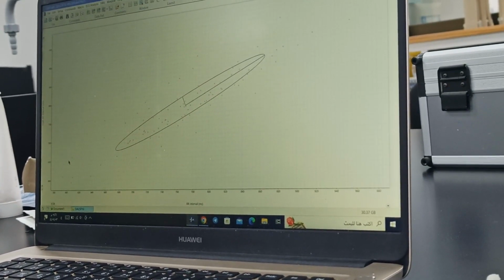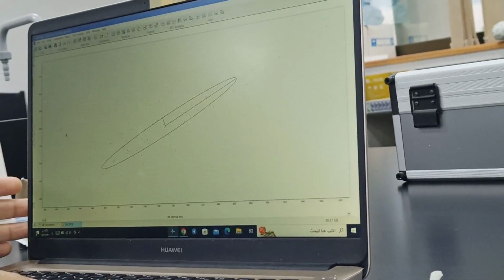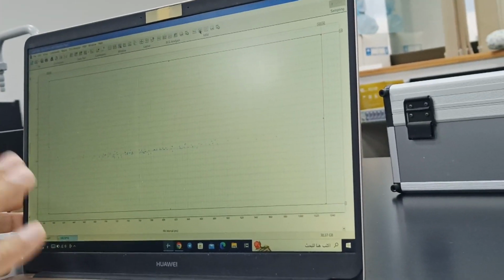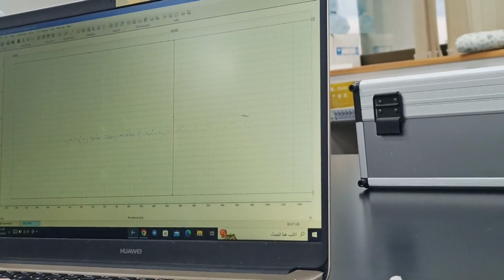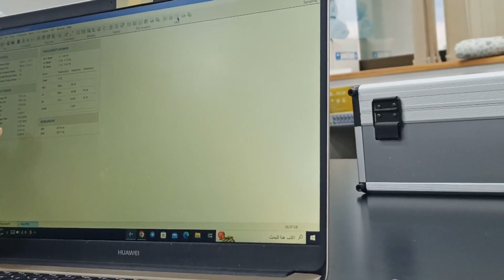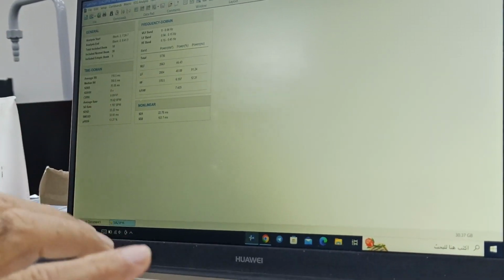This is just a brief introduction so that you know how to judge the data, and the beat classifier view is one important thing. Say if I change this one, first of all just see what the values were. For RMSSD 32, SDRR is 75.